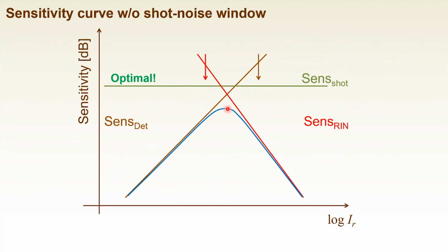So in this case, on one hand, you can accept it if it's not crucial. But if you want to solve it, you need to think about a replacement of the light source or the detector.